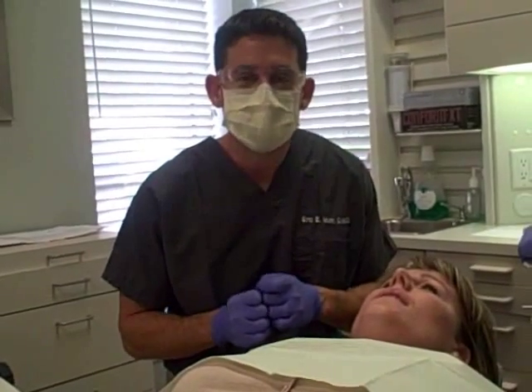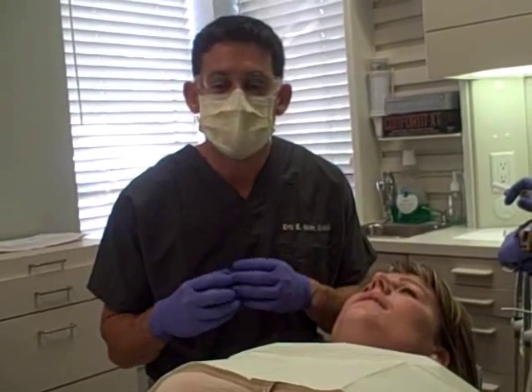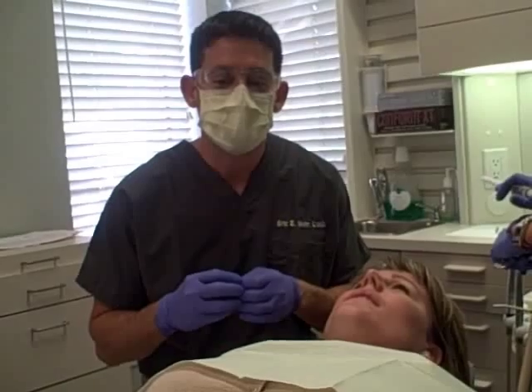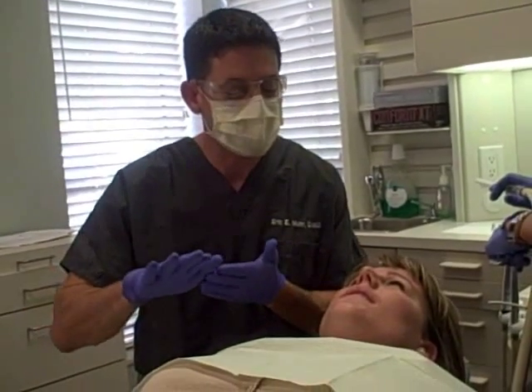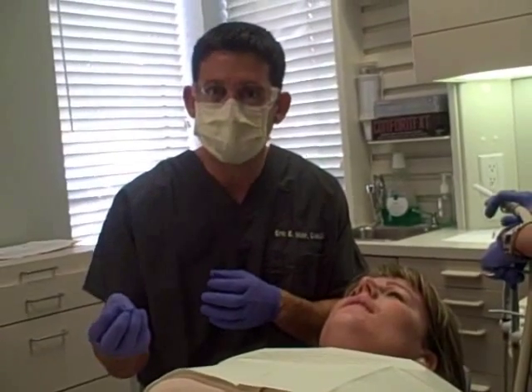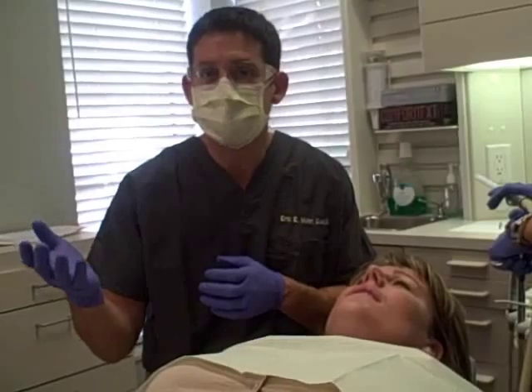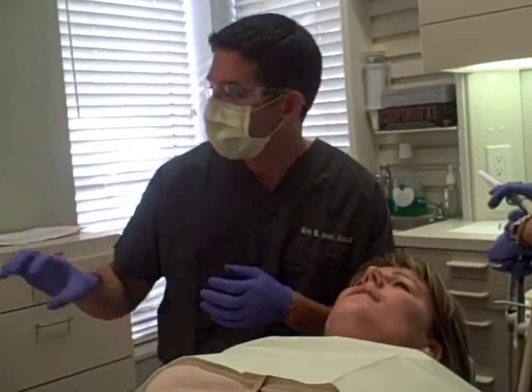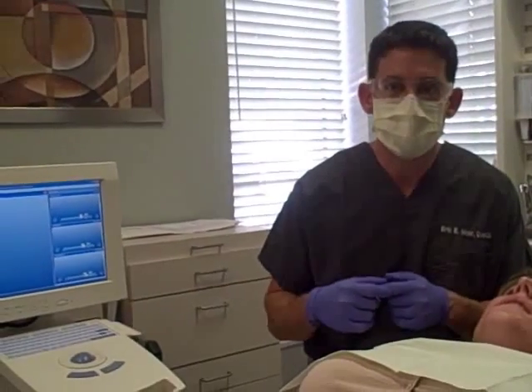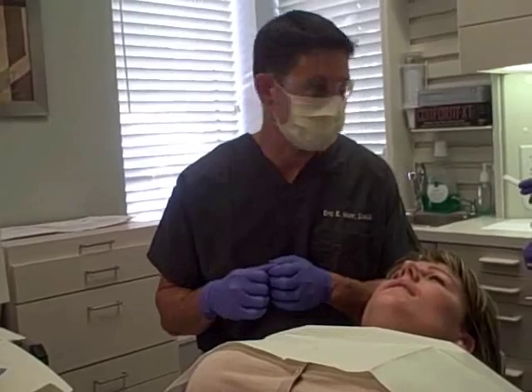We've finished cleaning up the tooth and preparing it to restore. Our next step is to spray the tooth with a reflective powder, which creates a thin film over the top of the teeth. We're then going to use a light-sensing camera that sends a signal down, reflects off the surface of the tooth, receives it again, and basically creates a topography on the computer — all step-by-step as we begin to repair her tooth using the CAD-CAM technology.